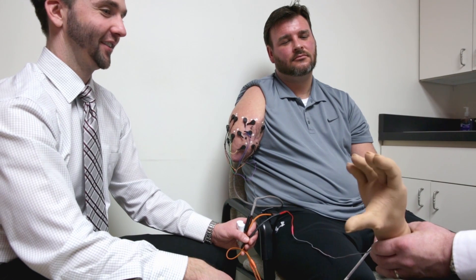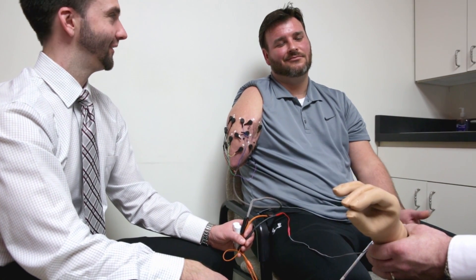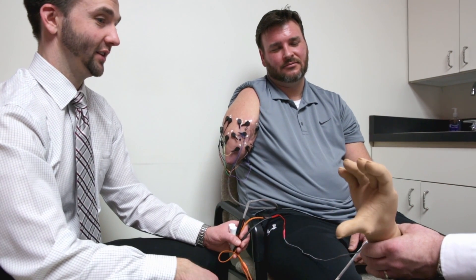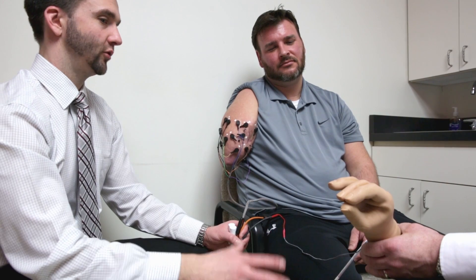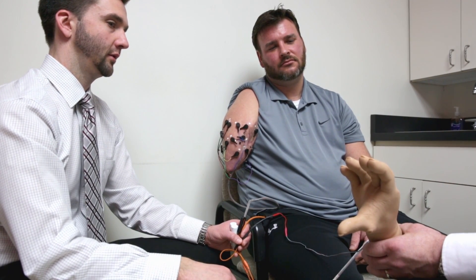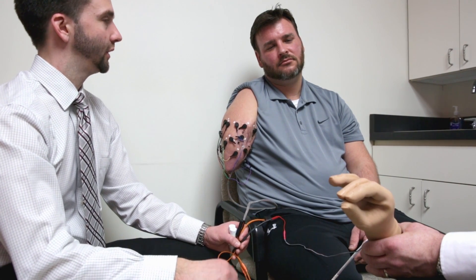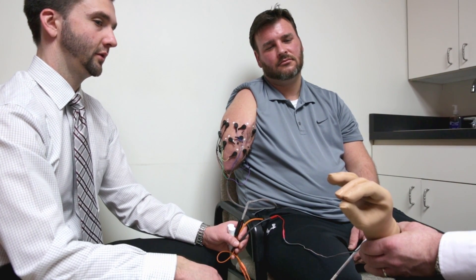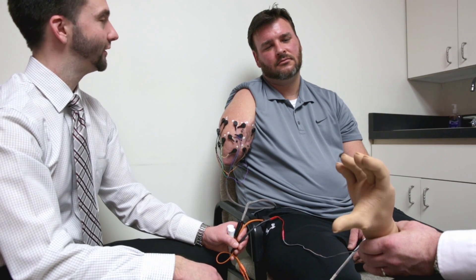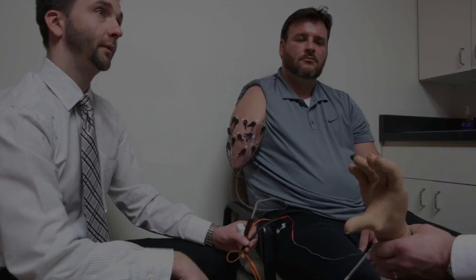Great. You want me fast, slow? It doesn't matter — that's fantastic. So try this: you get it open, try to close it a little slower. Very good. And open a little slow. Very good. Takes a little getting used to that, but the proportionality gets built in.